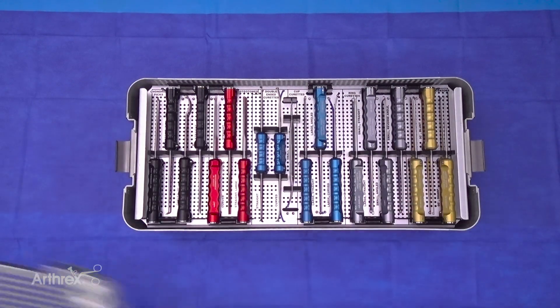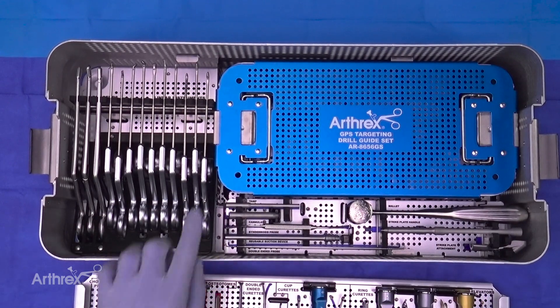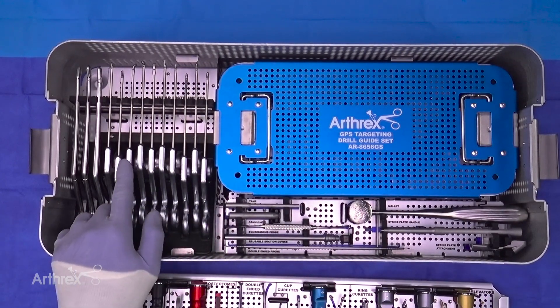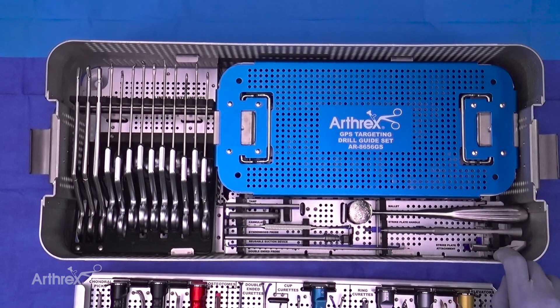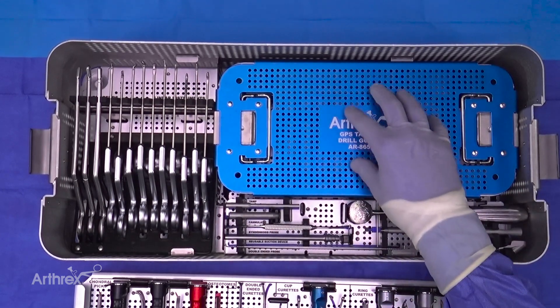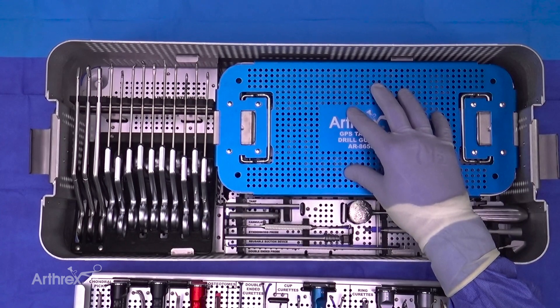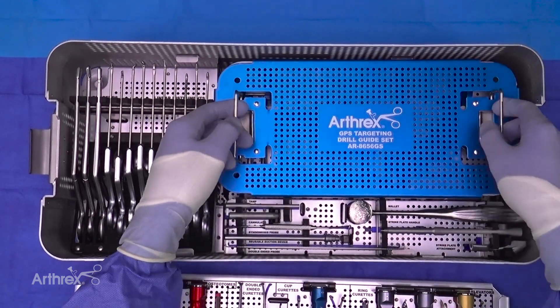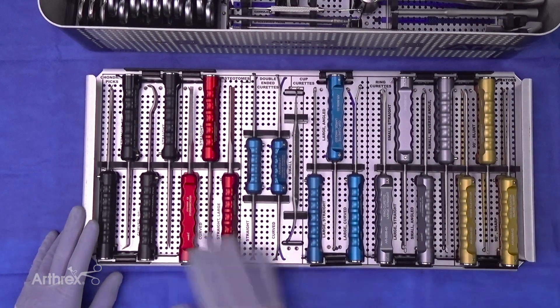As I pop the lid, you'll see that everything is broken into tiers. This top level of instruments are all the joint preparation instruments. When you pick this first level up, you have a vast array of graspers, biters, punches, scissors, and rongeurs, as well as a few instruments specializing for microfracture, a syndesmotic probe, and a biologics delivery tube. The set also houses the current second-generation GPS targeting system, but since that is not a new set I'm not going to highlight it. You also have an auxiliary bin to stack various instruments the surgeon might want to use during arthroscopy procedures.